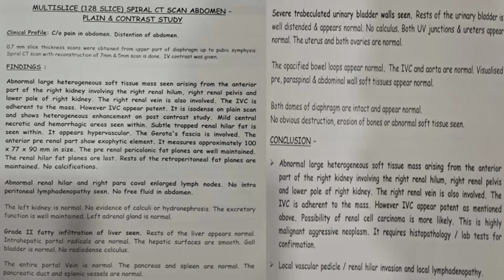What about MRI? Multiplanar CT, if it is done properly, is equally effective as an MRI. So MRI is preferred only if the thrombus level is equivocal or the wall invasion is not seen clearly on CT scan. Here, are you very clear about the vein?